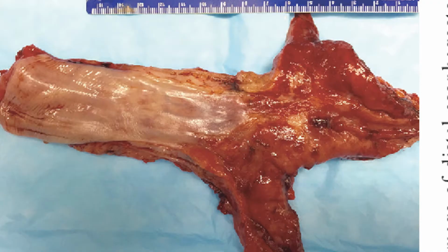Next is Barrett esophagus. This is the esophagus, and this is the lower part of the esophagus. In this area you can see the whole area become salmon pink. That's the area of Barrett esophagus.